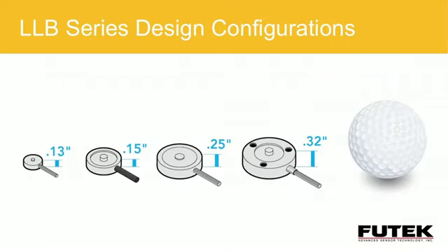A subtle but significant differentiator here with this design and many of our others is that for compression applications, we are using multiple strain gauges in these designs. That, with the spherical load surface, allows for a much more resistant design for extraneous forces. So with the additional strain gauges and the spherical load surface, if I have a situation where my load surface is not perfectly flat and parallel, my load cell has the capability to correct for that phenomenon.